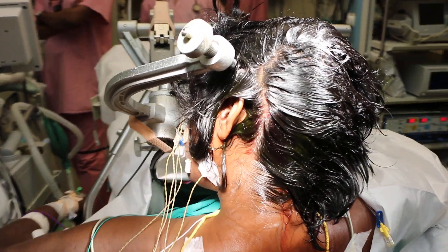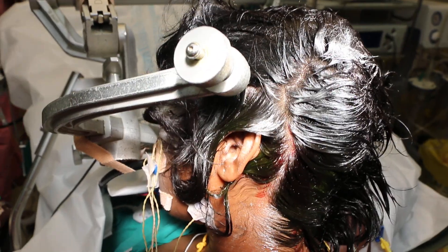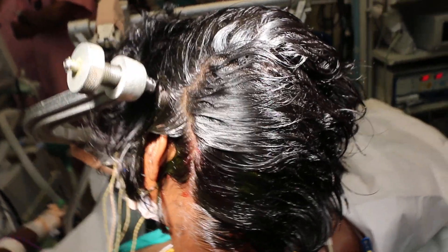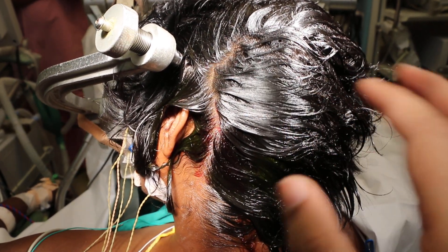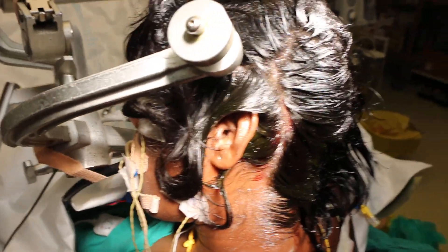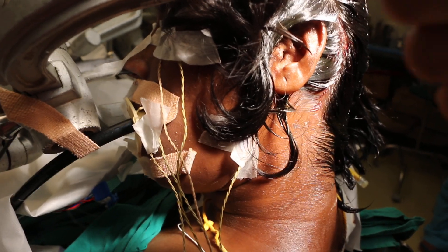The hair has been prepared. Notice that the head is tilted so that the chin points towards the side of the lesion and is tilted to the right side. This tilting allows the cerebellum to fall towards the right side, since retraction is assisted by gravity. There are multiple leads which have been placed.